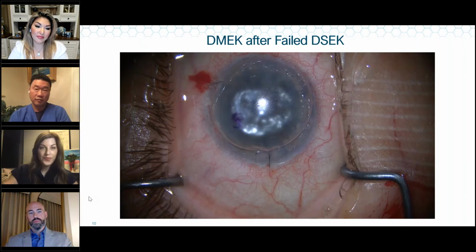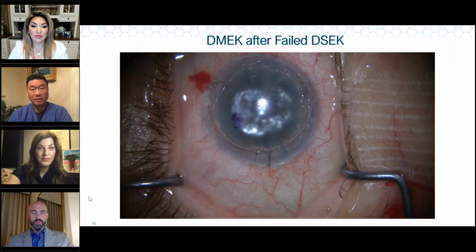But DMEK is very different. I think Jose Güell is the one who told me, because I was noticing that my DMEK grafts were detaching. I mean, not small detachments, large detachments. I think I was just knocking out endothelial function with that high pressure, because it's very different from DSEK. I want a pressure around 10 to 15, pretty soft, and I'll touch it with a dry Weck-Cel sponge to check that it is soft. I aim for about a 90% fill with the 20% SF6 gas. I only wait 3 to 4 minutes, so it's half the time that I do for DSEK.